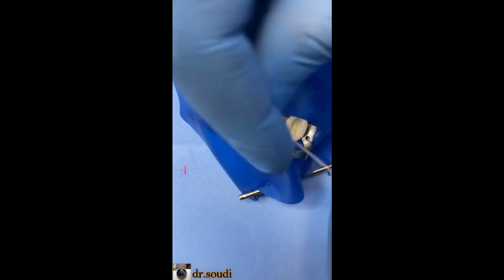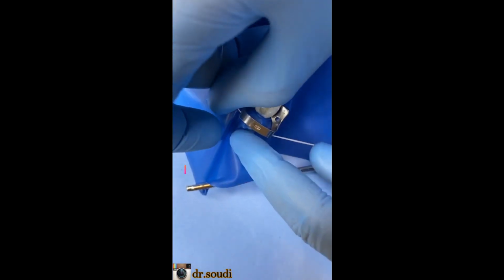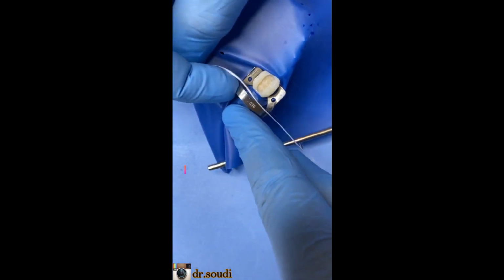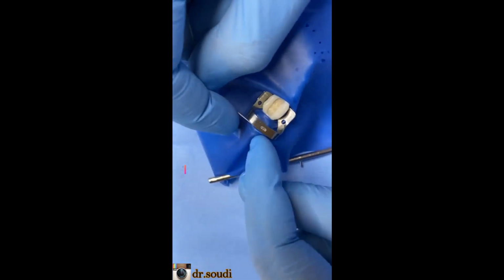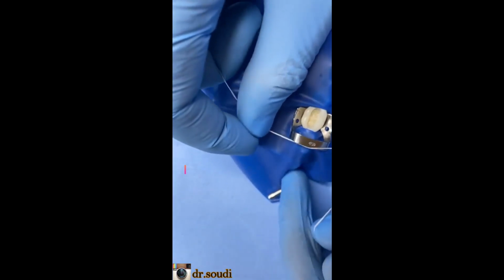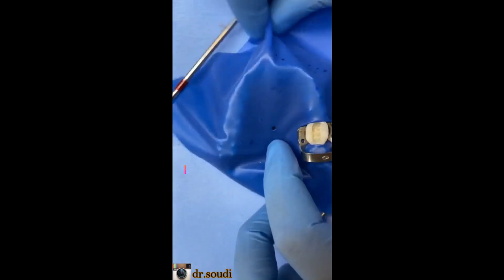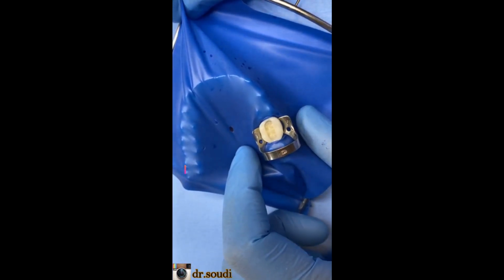Okay, because it's moving, I need someone, but I don't have anyone here with me. So you should pass it from the posterior end of the clamp. You know the idea now. It's moving now. Sorry. Okay, you got your isolation right now.